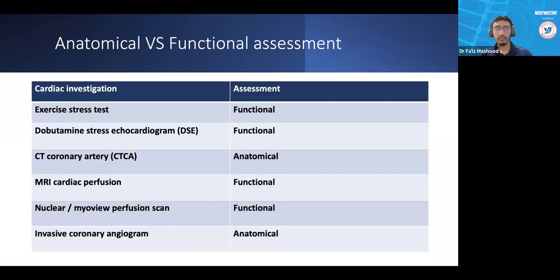And let's say there's a perfusion defect, for example they mention the anterior segment has a perfusion defect, and we can understand the anterior segment is likely supplied by LAD, for example. So we can presume that LAD is the culprit vessel, most likely having significant stenosis, and we might need to intervene later as well. All right. This is the first option on how to differentiate each of the tests, which is anatomical versus functional assessment.